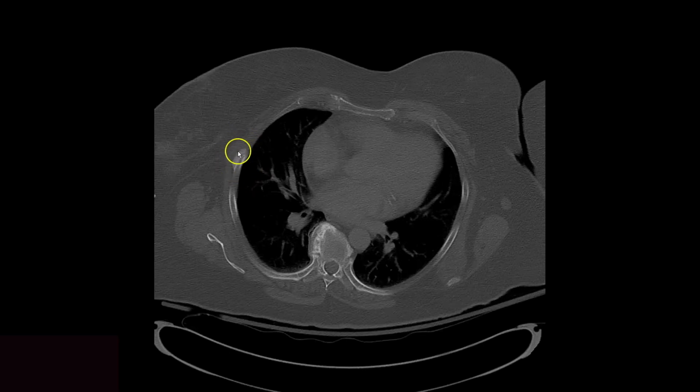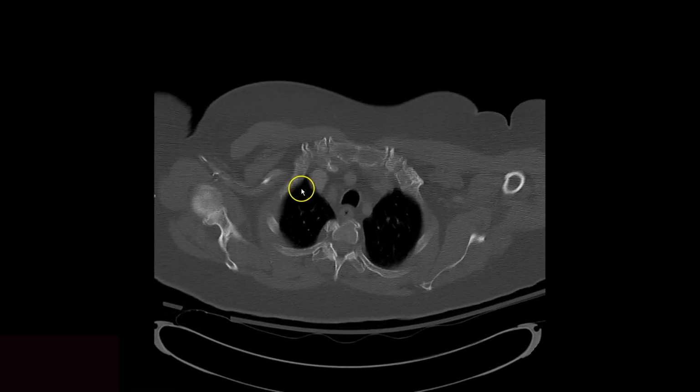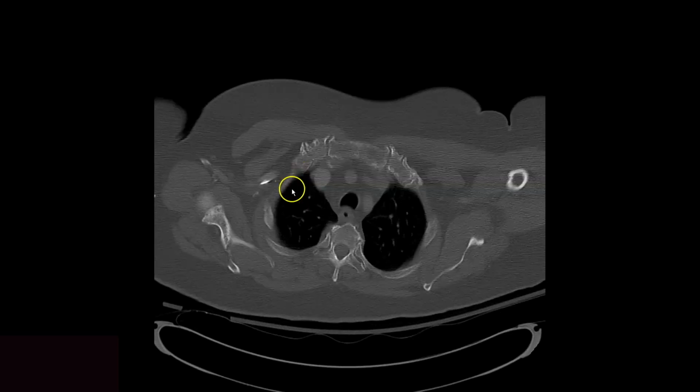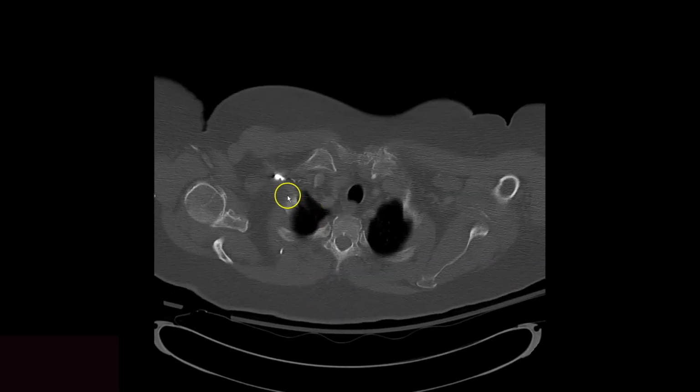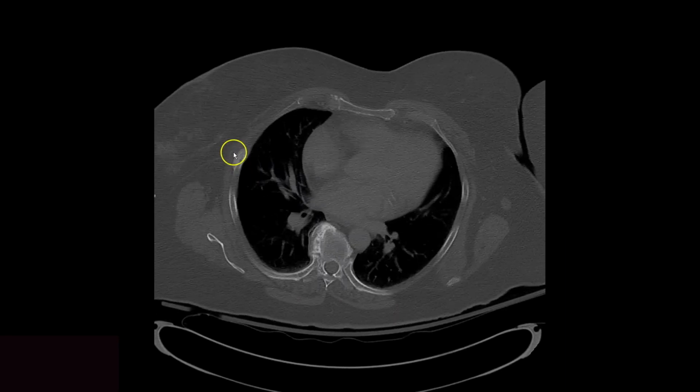So the way I do that is I just start with 1, 2, 3, 4, 5. So I'm at the top of the chest, and I already know that's the 5th rib that was fractured, and we can double check that. So that's the first rib right here. 1, 2, 3, 4, 5, and we're back at the same fracture. Obviously, this patient has other rib fractures.